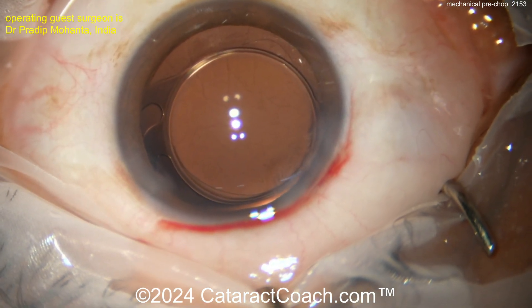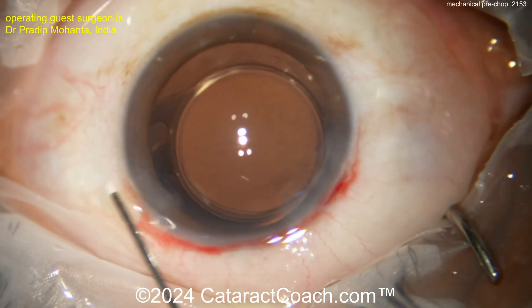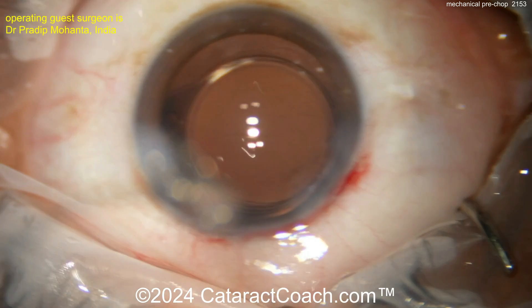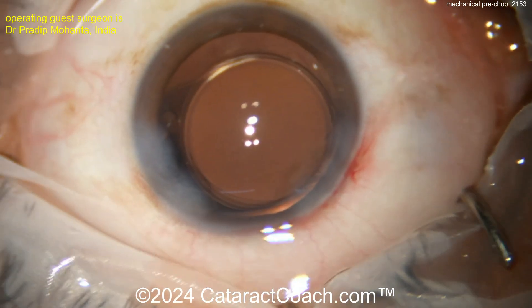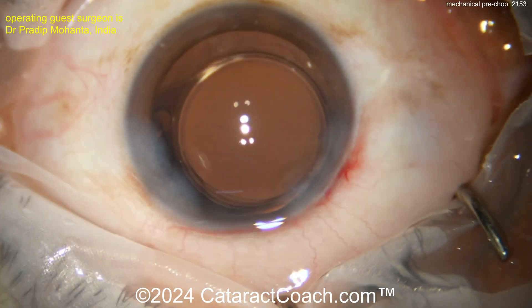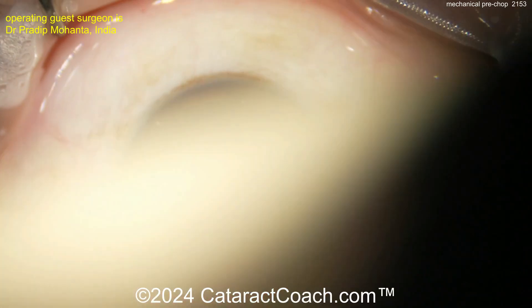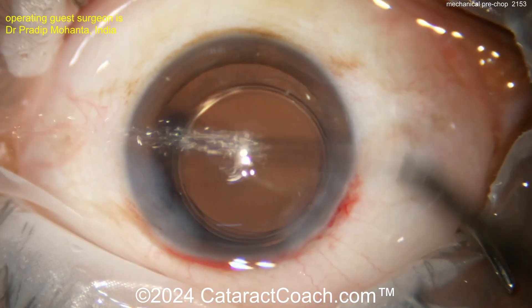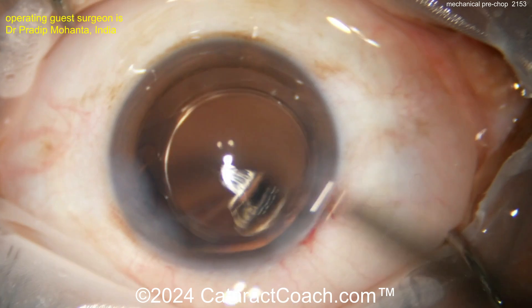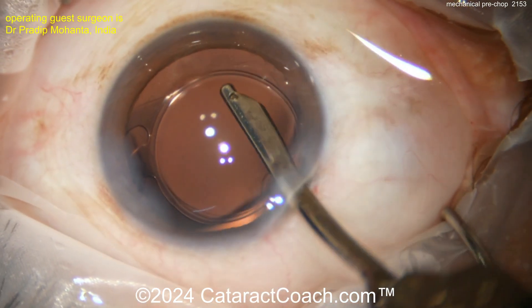End of the case: irrigation-aspiration cleaning up any remaining viscoelastic, then sealing up the incision. Looks beautiful — a nicely positioned single-piece acrylic lens in the capsular bag. Notice how the main incision and the paracentesis are about 90 degrees apart. That's helpful for this chop technique — you don't want your phaco incision and paracentesis too close together, otherwise it's a mechanical disadvantage. Check out this mechanical pre-chop technique and add it to your armamentarium of phaco techniques.